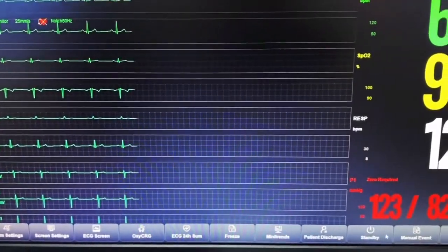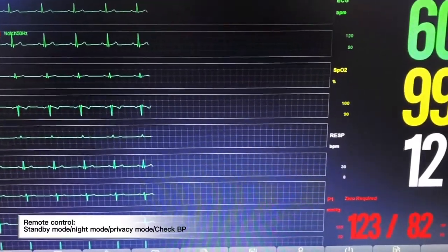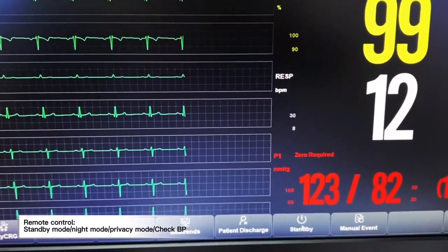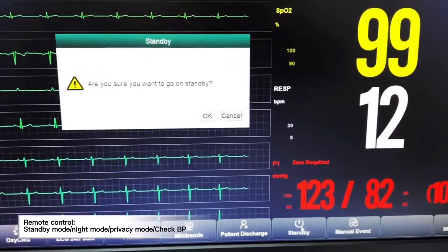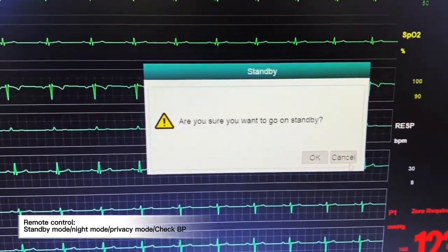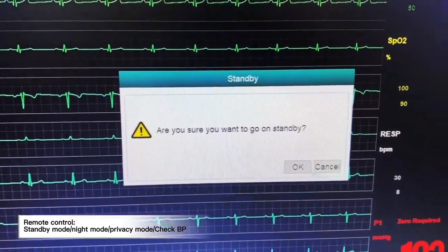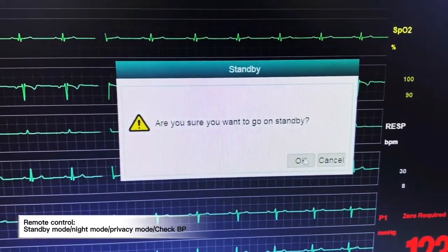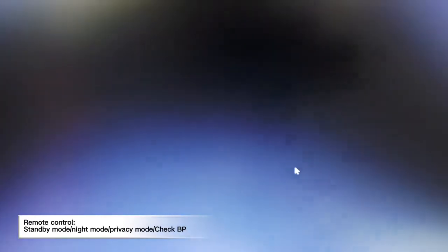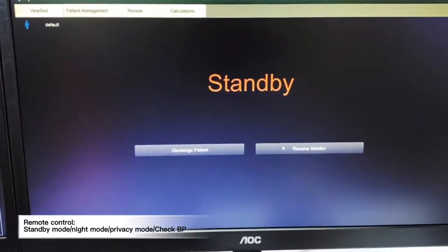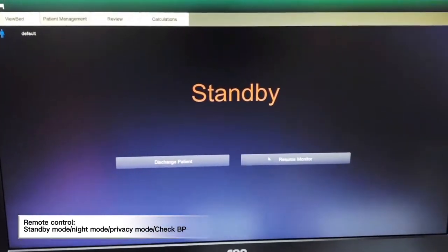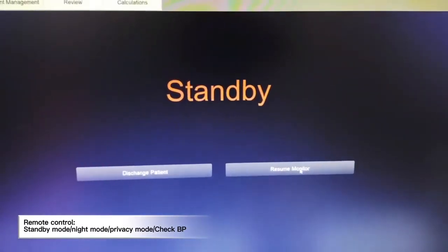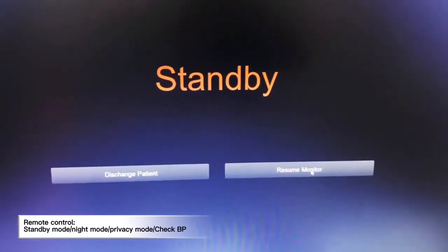From the CMS we will also be able to remotely put the patient monitor into standby mode. Once we click standby, the system will prompt us a notification asking if we are sure we want to go to standby. We click OK, and the respective monitor will go into standby mode. We can also resume monitoring.